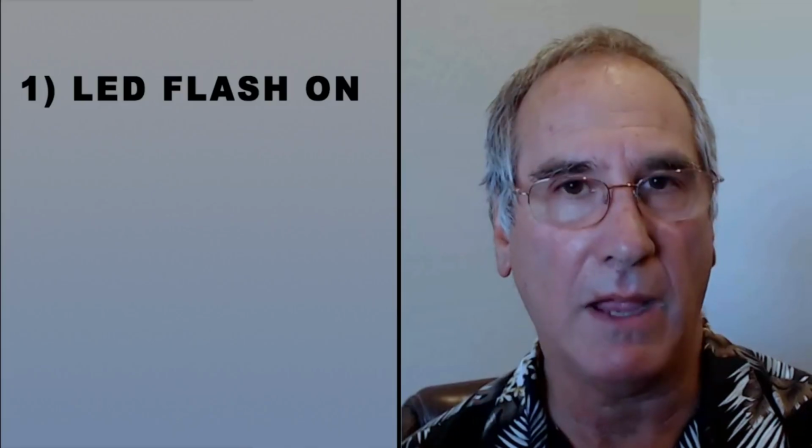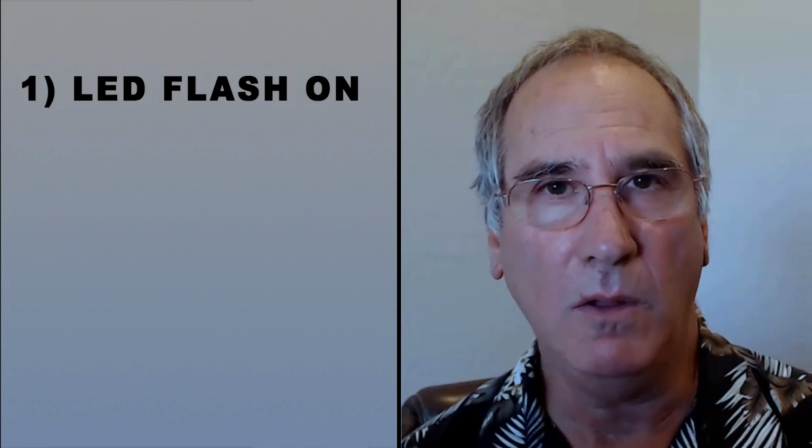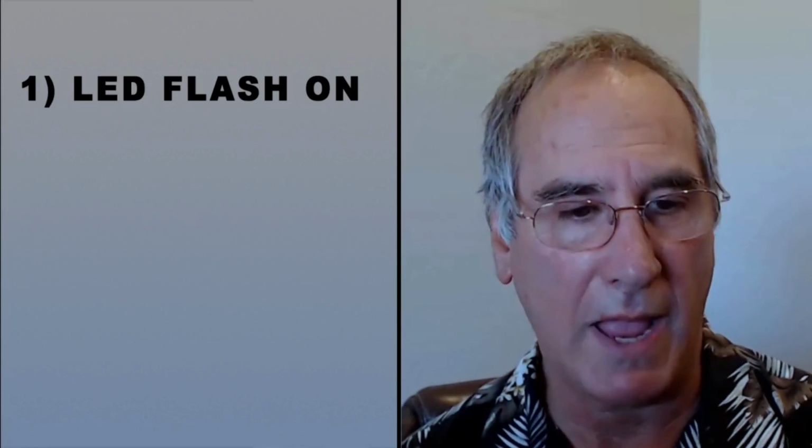and I'm telling you, the picture quality can be just really great, again, if you know what you're doing. So I'm going to mention 5 things that you can do to set up your camera the best that you can. And number 1 is activate the flash. Take all of your dental pictures with the flash.